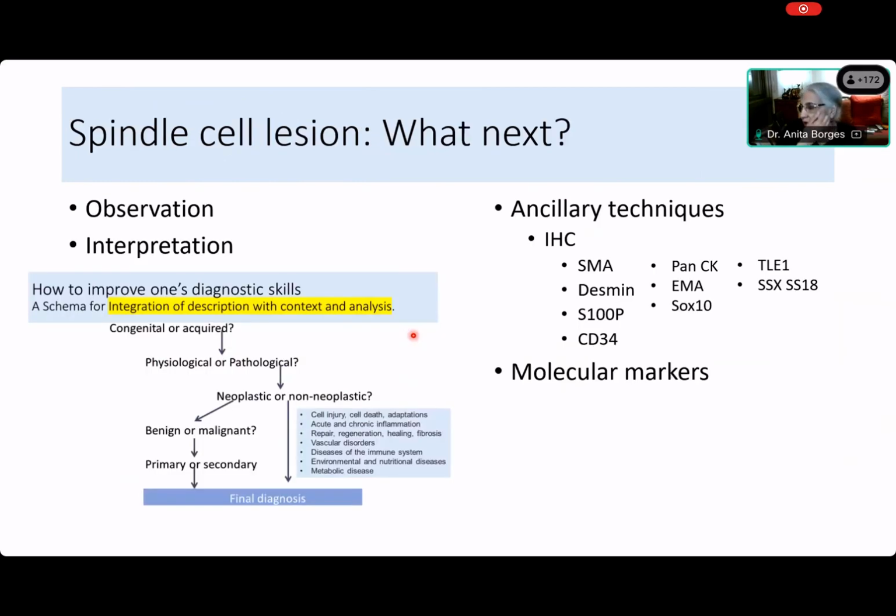Now we come to the meat of this talk, and that is a spindle cell lesion. What next? How do you approach a spindle cell lesion? How do you analyze it? The first thing is that you have to make a good observation. Number one, you can't call something a spindle cell if it is not a spindle cell. So you have to make your observation. The observation is not only about the cell, that it is spindle; you have to look at the type of nucleus, whether the nucleus is bland, whether it has mitosis, so you do a lot of cellular observation. Then you have to look at the pattern in which these spindle cells are being arranged. It's also part of your observation.